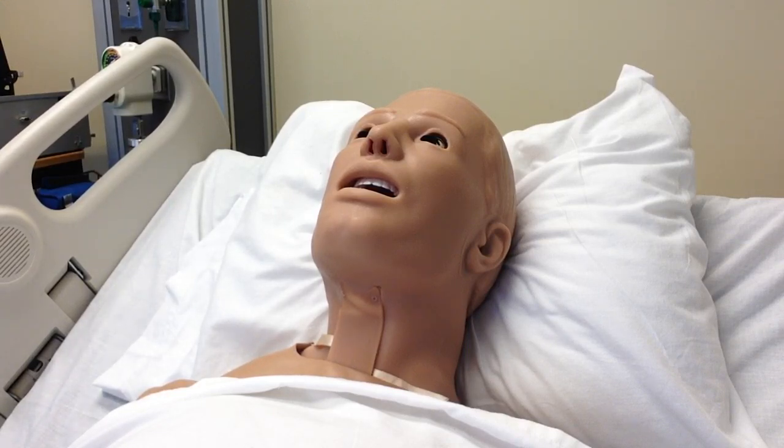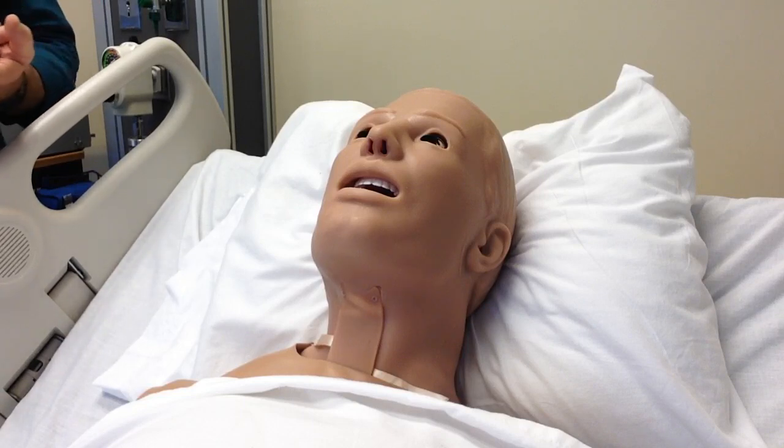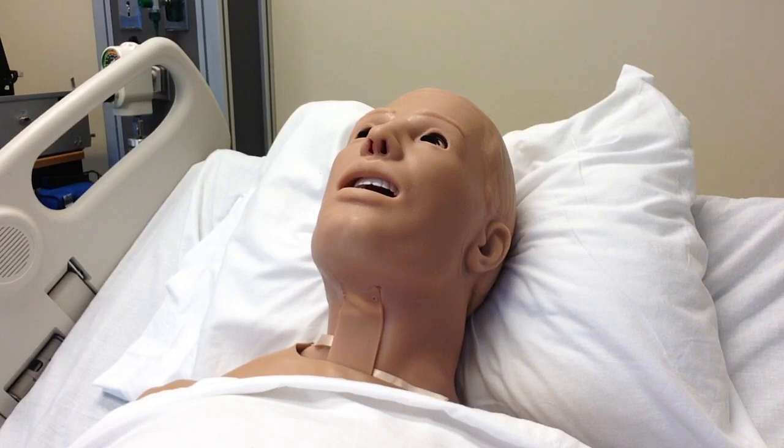cannula for an adult on a 100% from the wall. So wall is always 100%. With that, 1 liter is 24%, 2 liters is 28, 3 liters 32, 4 is 36%, 5 is 40%, and 6 liters per minute is 44%. A nasal cannula on an adult can go from 0 to 6 liters per minute.